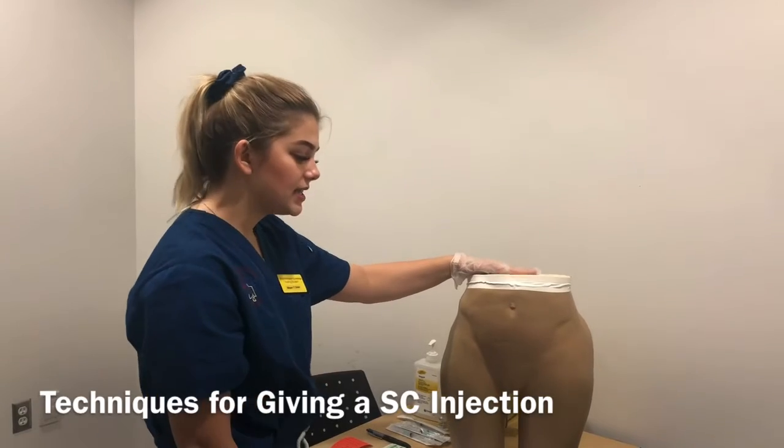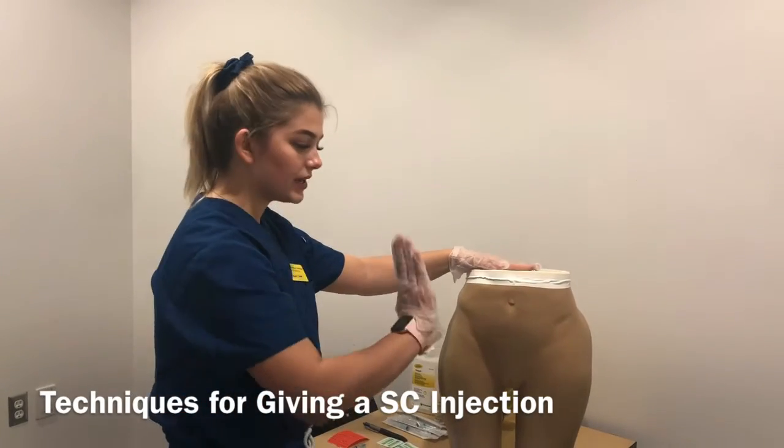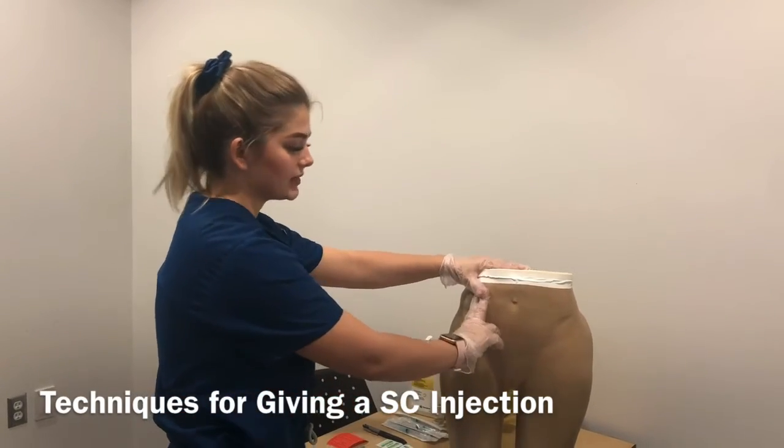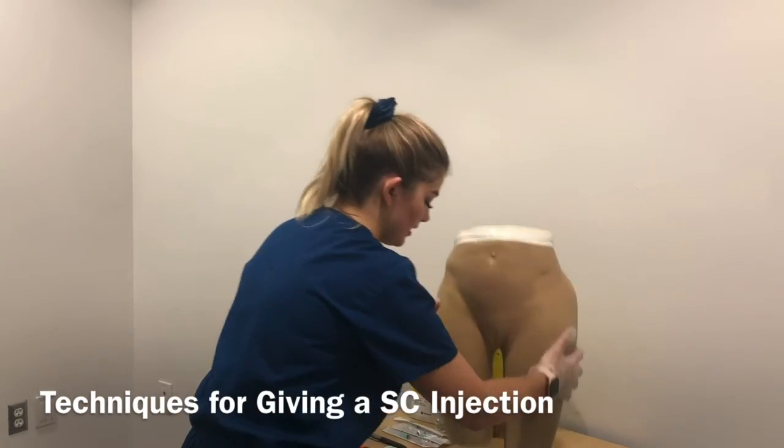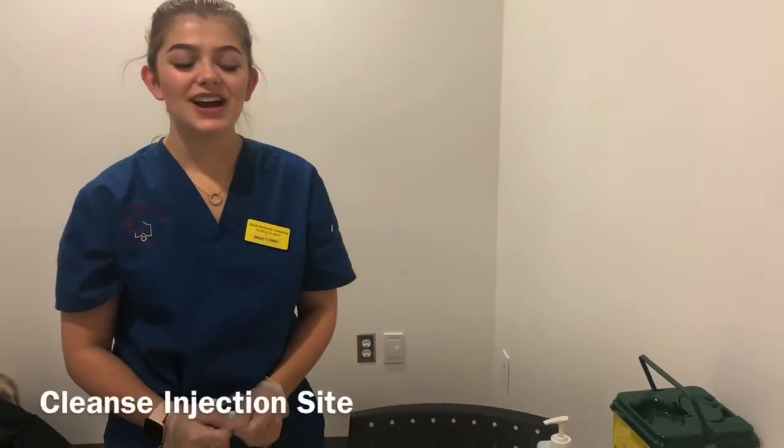So Mr. Mancini indicated that he hasn't been injected on the left side yet. The last side was on the right. So I'm going to go ahead and administer the medication. Okay, so before I inject Mr.